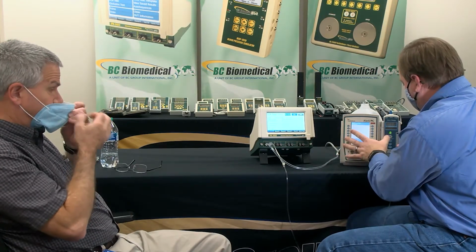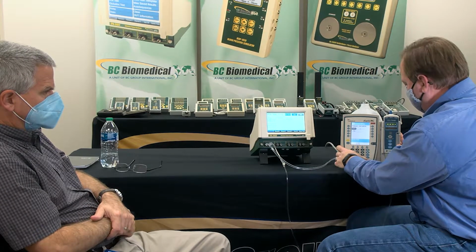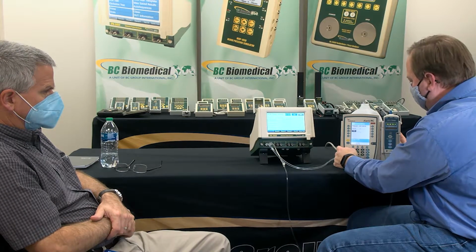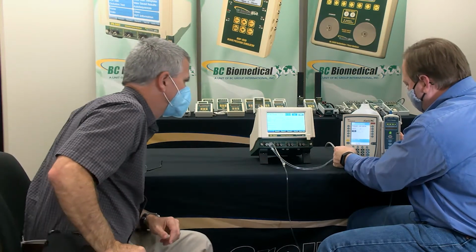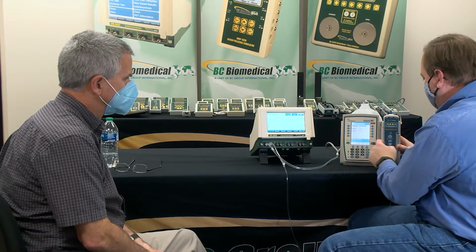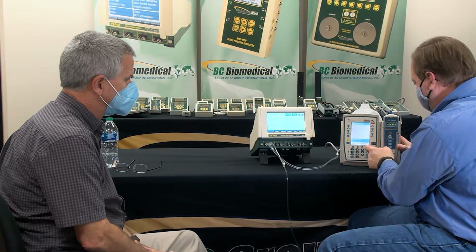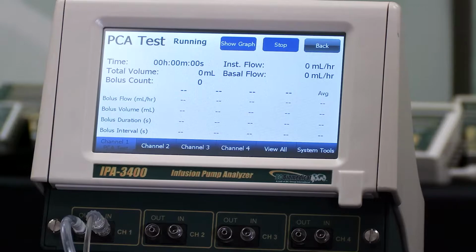So we can say channel A is 20 milliliters per hour. That's what we told it. And volume is, let's just do 100. Get a number in there, 111. That's wonderful. Okay, so we can start that. And it's going slow. Okay, so it detected that. It's got the basal flow rate. It's doing its thing. Now I'm going to go in here.